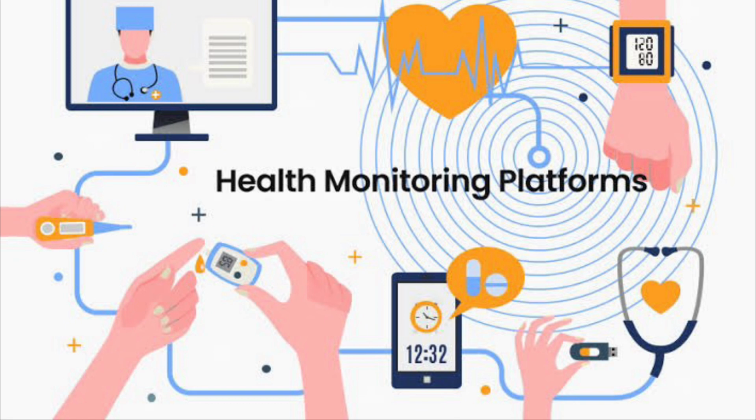But whether it can be a substitute for the intermittent vital signs monitoring for all the admitted patients in the common wards. For example, there's a patient admitted for fever or just a routine evaluation. Does he need continuous vital signs monitoring in the ward? This will generate quite a lot of data which is unwarranted. It will lead to a lot of false alarms.